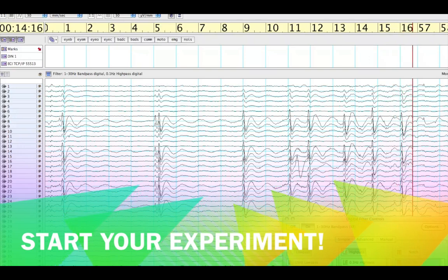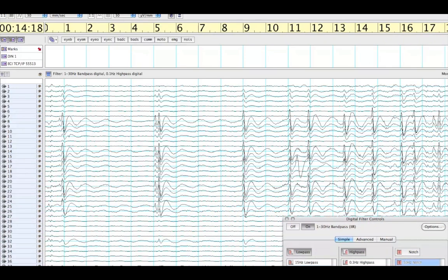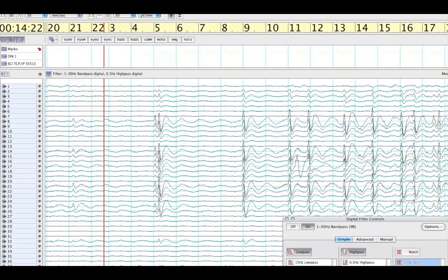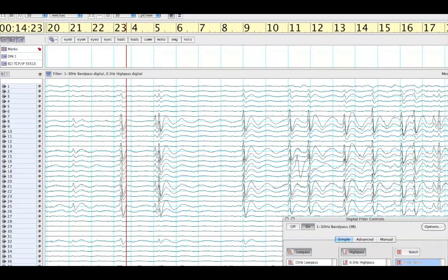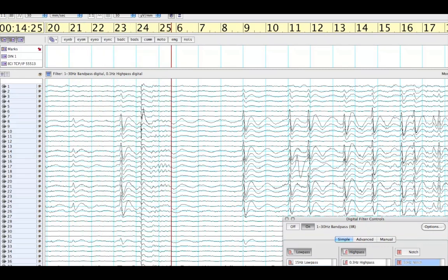And that should do it. Now you're ready to ask the participant to start the experiment and press record to begin recording your EEG signals.